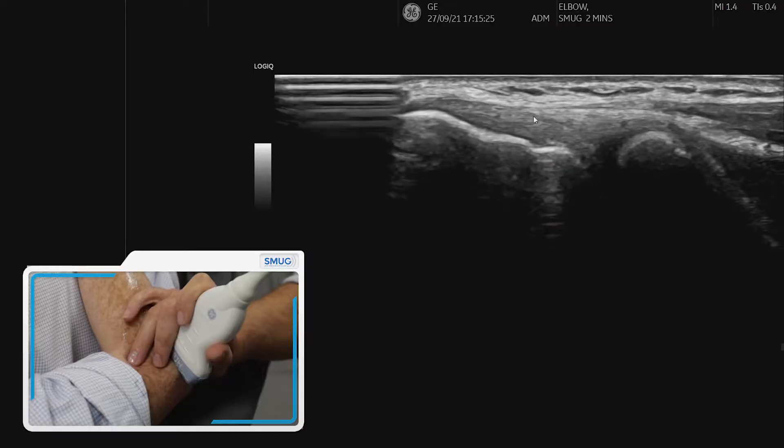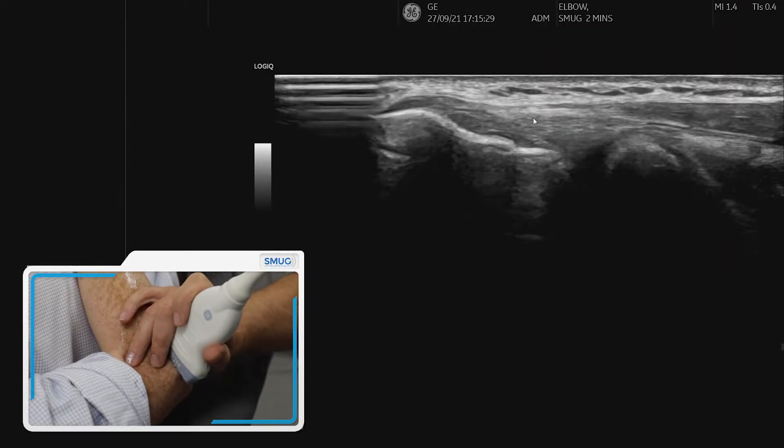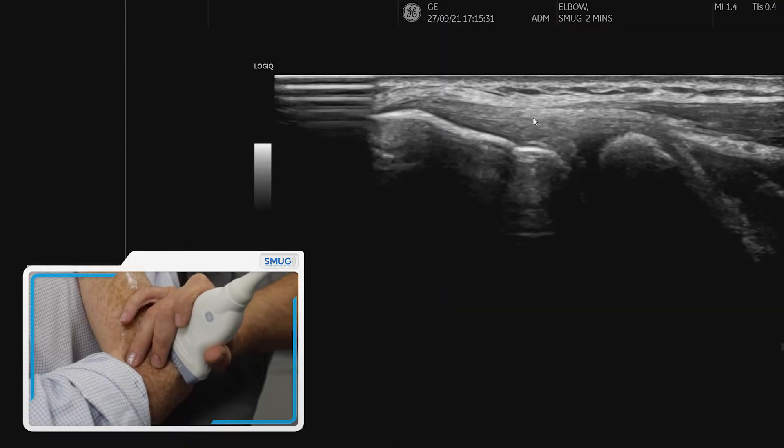Now often we will see this view, but it's important to understand that most issues when it comes to tennis elbow actually involve the ECRB tendon specifically.